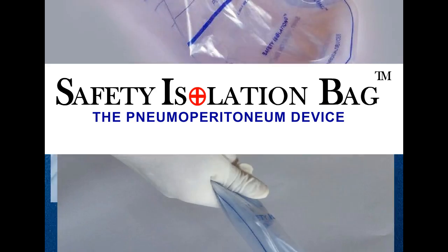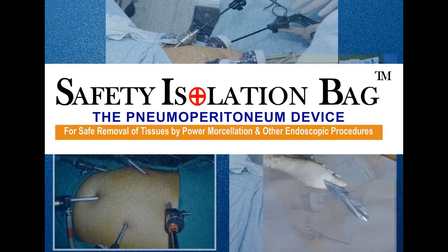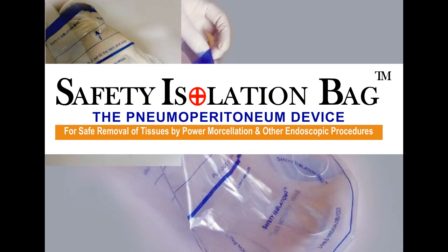The Safety Isolation Bag — The Neoperitoneum Device for safe removal of tissues by power morcellation and other endoscopic procedures.